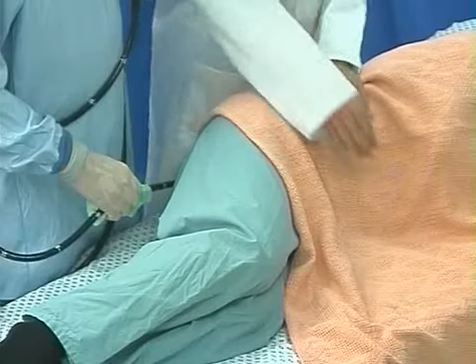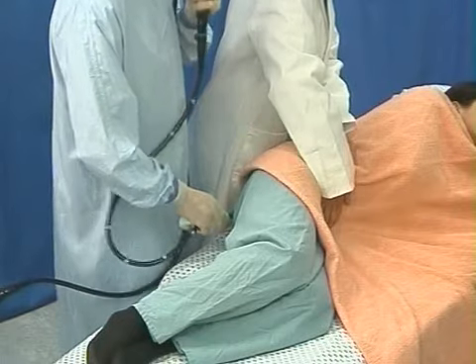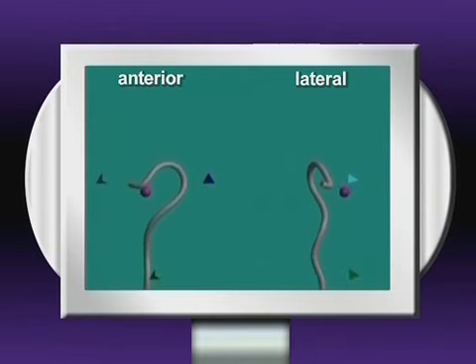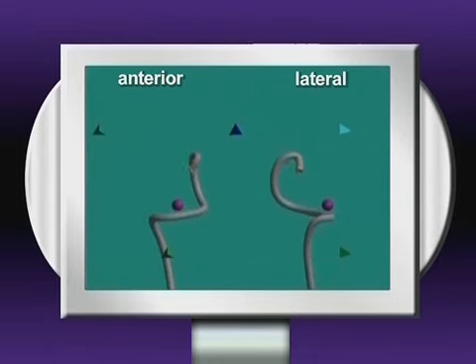Studies have shown that without using scope guide, sigmoid hand pressure is ineffective 2/3 of the time, either because the loop is inaccessible or because pressure is in the wrong place. Here, pressing exactly over a transverse loop helped make the scope slide in proximally. Here, attempted sigmoid loop pressure was ineffectual.